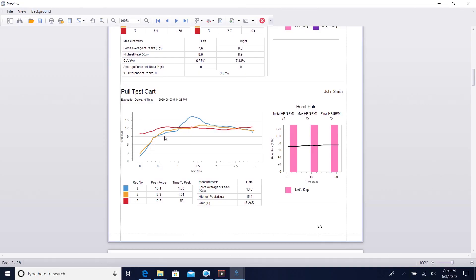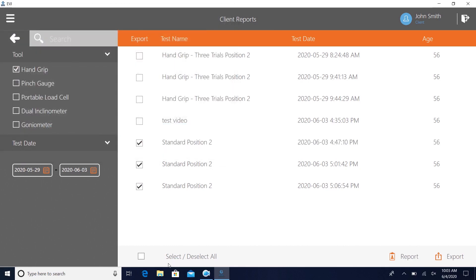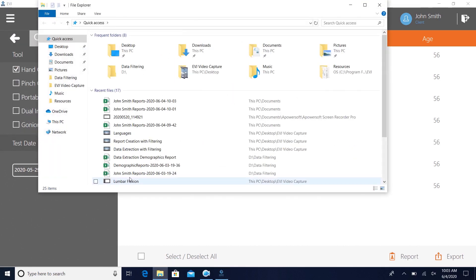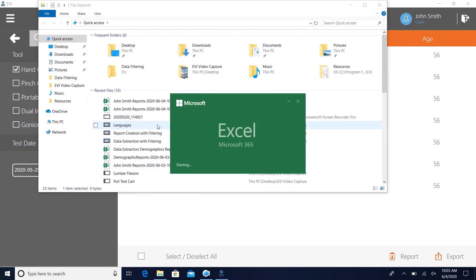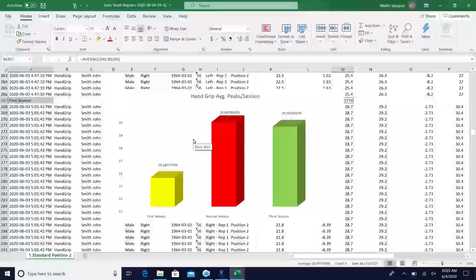Save time writing notes in the clinic with the EVJ's electronic medical record integration. Evaluate a variety of job tasks. Provide employers with easy-to-read FCE reports. Make your research data and QMT cleaner and more reliable with streamlined data management that saves you time and prevents errors. Give your students hands-on experience with assessment and building reports in the classroom.